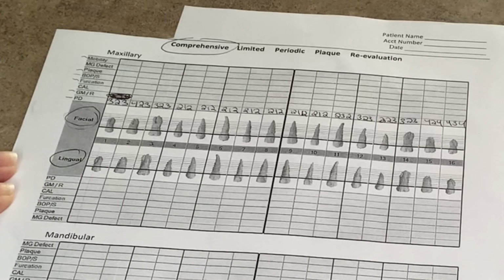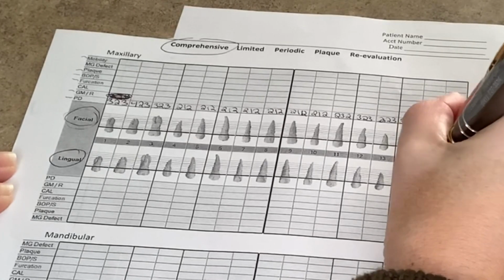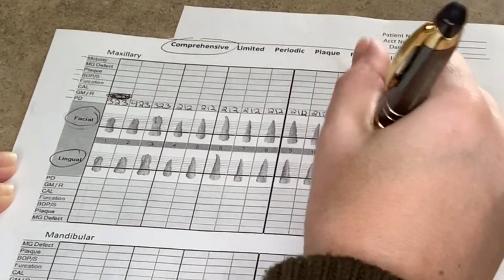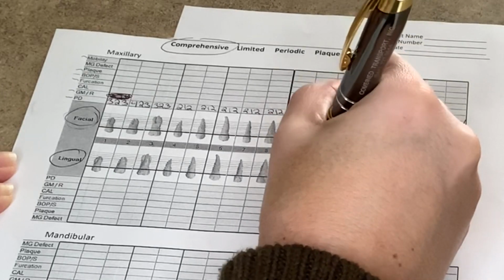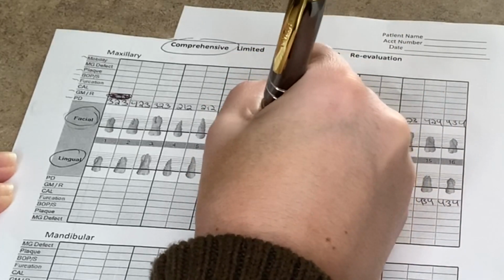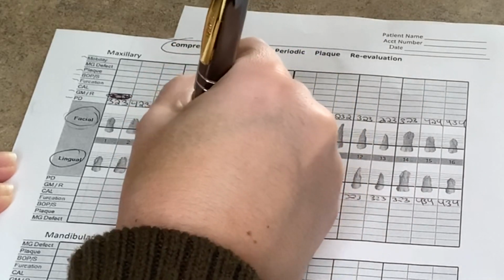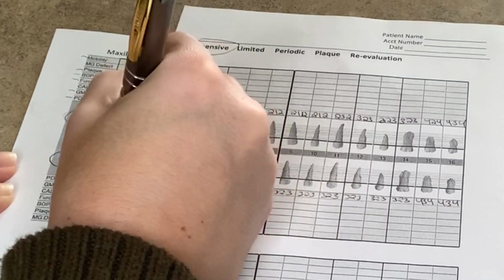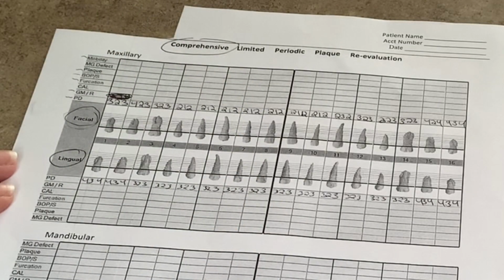And then you'll go and swing around and go to the lingual. So you'll start on the facial of number 1, go all the way across, and then come back around to 16 lingual. And then go from 16 to 1 on the lingual side. Again, with the hygienist reading numbers out to you like 323, 323, 323, 423, whatever the readings may be. So I'm just going through and filling it out. And then once you finish the top, the hygienist is going to go down to the bottom and do the same, but we're going to skip that and just focus on the upper right now.